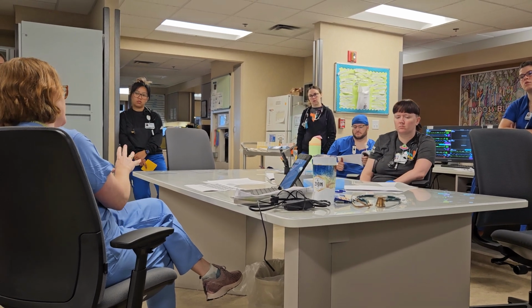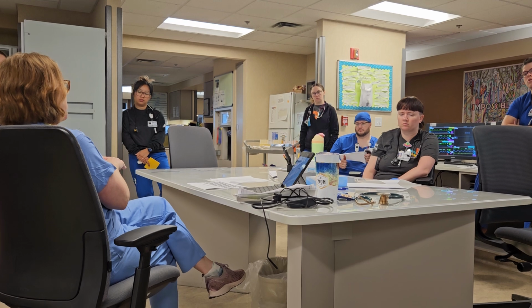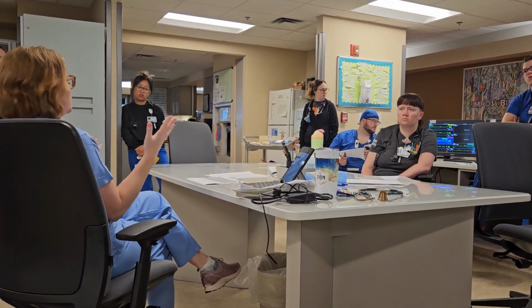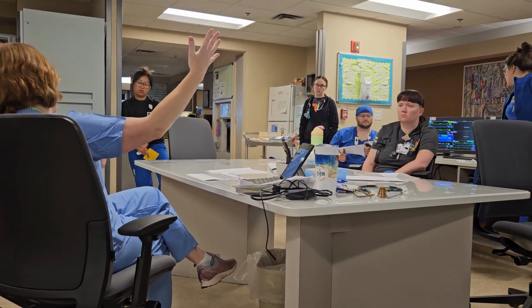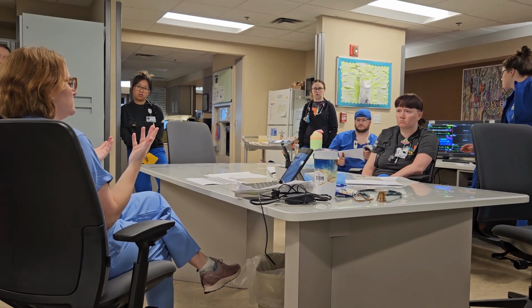And what we adjust there is largely dependent on the patient's lung compliance. What are their airway pressures? And how much more volume can they tolerate before putting their pressures too high and putting them at risk, etc.